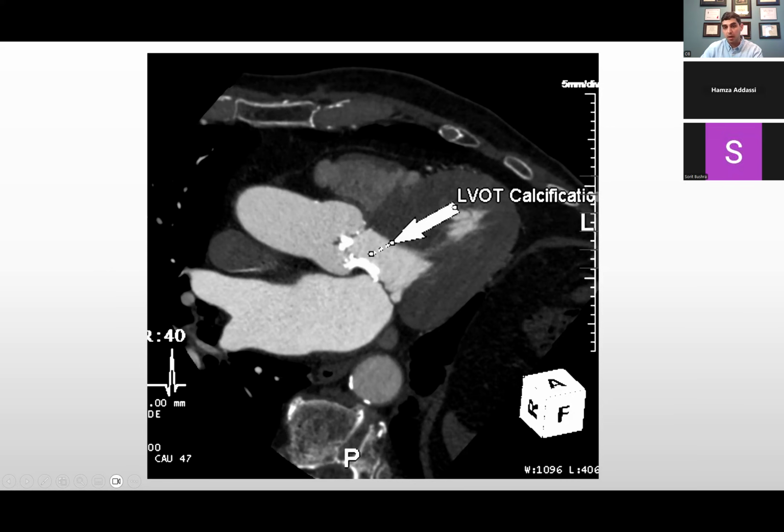We have to fix that problem. And the way to fix this problem, the idea of not using a balloon expandable valve, using what's called a self-expandable valve, something where you unsheath it. So if you pull something back, it starts opening. So that's what we did in this case. This was 2 weeks ago.